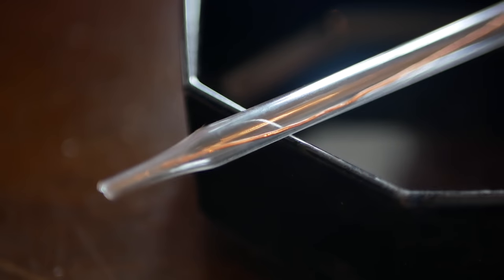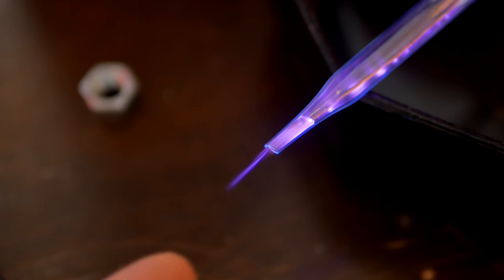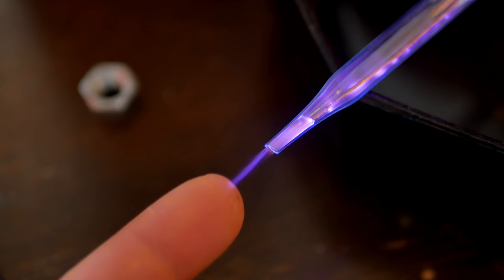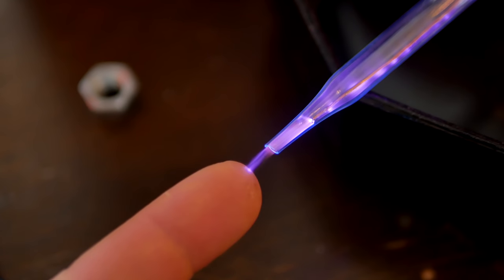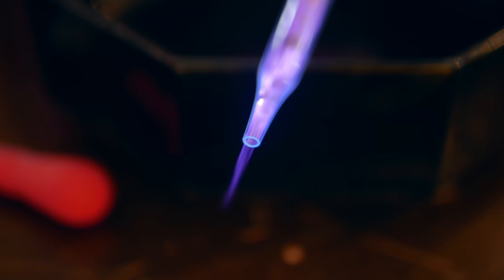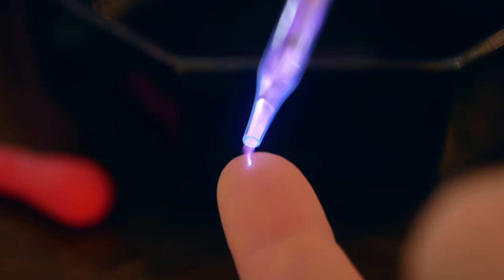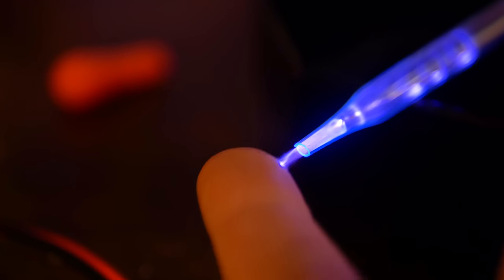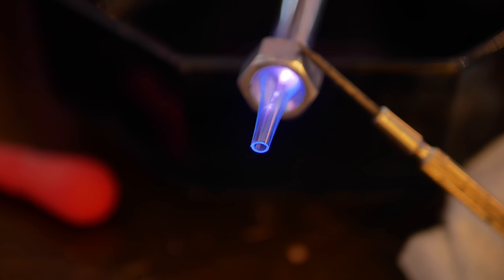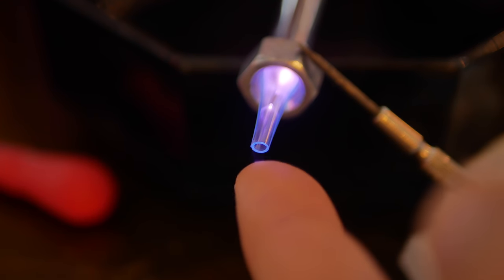Finally, I gave glass pipettes a try. They offered the perfect chamber to place an electrode down and an airtight connection for the helium tube at the back. It took a few tweaks, but this setup showed promise. The nozzle was focusing ionized helium into a point, and it was touchable. It was cold to the touch. In the dark, it looked epic. I added a ground electrode just to try and increase the dielectric barrier discharge, but it totally ruined the output.